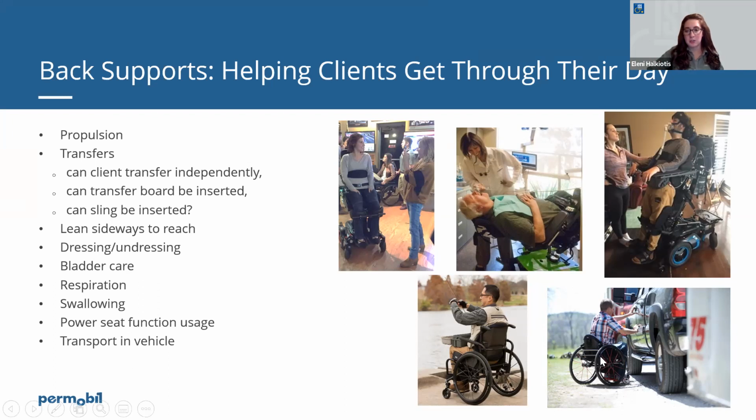Transportation to a vehicle. Do they drive a big pickup truck and they need something lightweight that they can load in and out of themselves? Do they never need to fold up their chair? And maybe that will tell us what type of hardware the back support is mounted onto the system with. If they never need to fold it up and they have a lot of tone and they're very heavy on their equipment, maybe fixed hardware would be most appropriate for mounting the back support as opposed to adjustable, removable hardware.